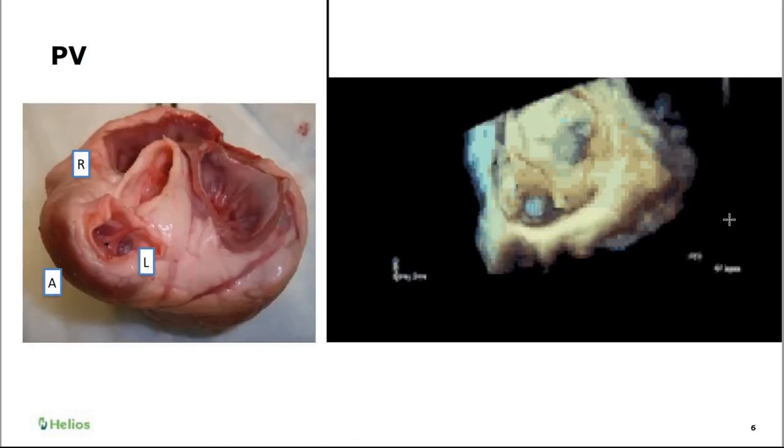Okay, so if I take this block that I had and rotate it the other way, I look inside the pulmonic valve. Here I can see inside the pulmonic valve. This is now en face for the pulmonic valve, and this is the aortic valve in the other direction. So here I look into the pulmonic valve, and the aortic valve comes on this side. This is another feature that we can easily appreciate from 3D echocardiography, and we can clearly see it coming up there.